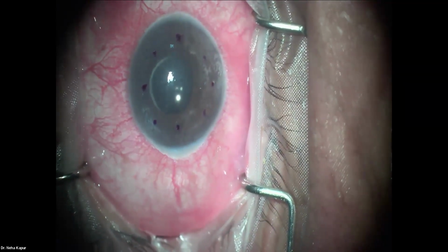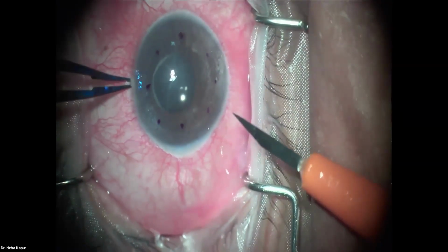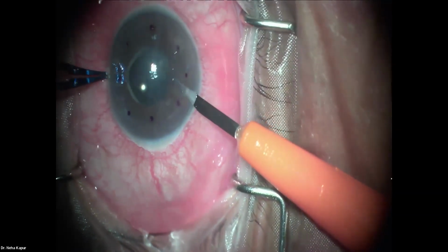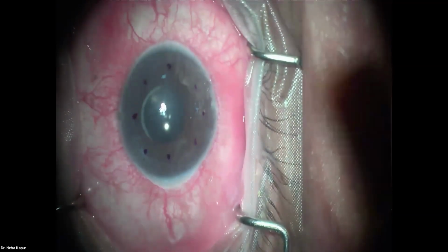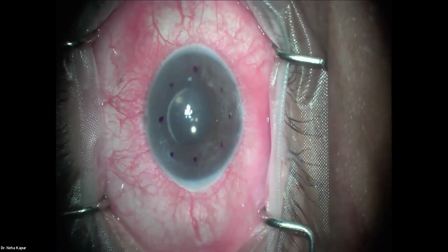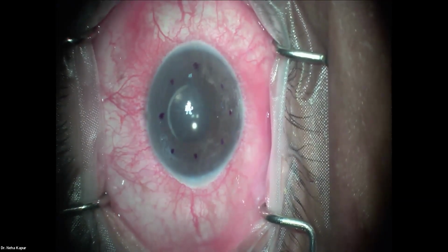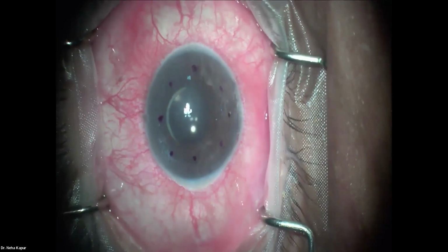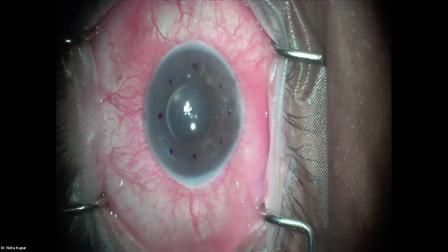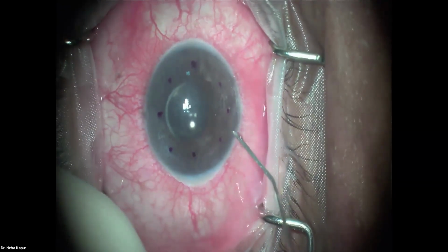Then we go ahead and make a side port incision. So we use a 1 to 1.2 mm side port blade, but we don't make a full entry. Just about half thickness is adequate. And like we've earlier shown you, Descemet scoring under trypan blue, under viscoelastic, and with the anterior chamber maintainer with fluid. I'm going to now show you under air how we do it, so that way we cover all three modalities.